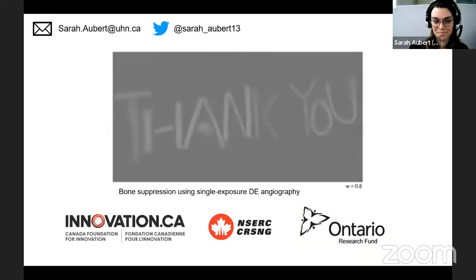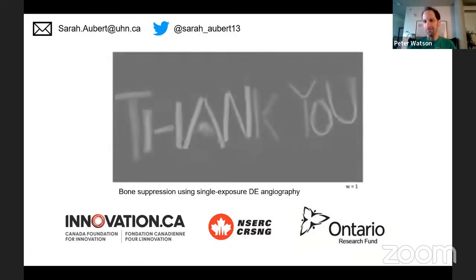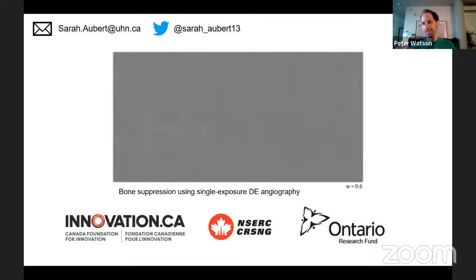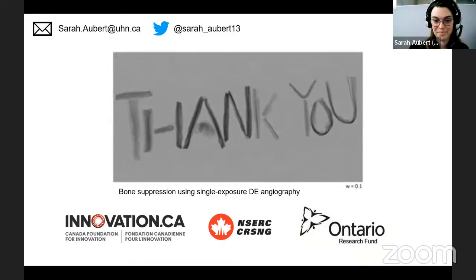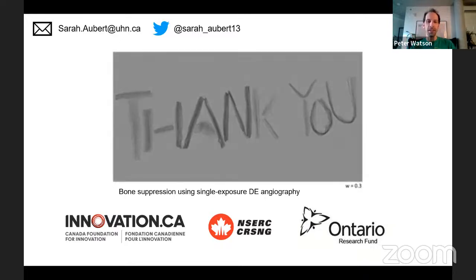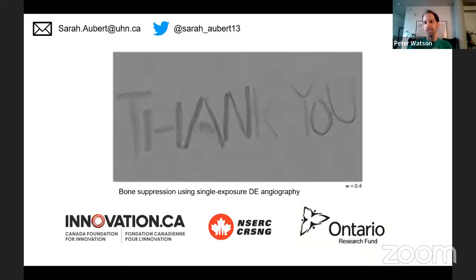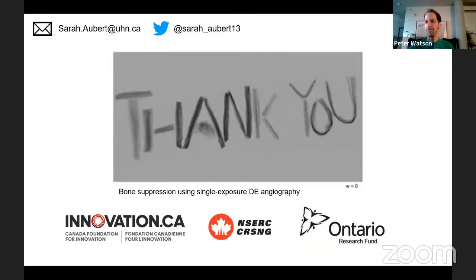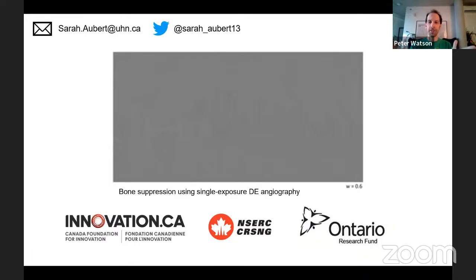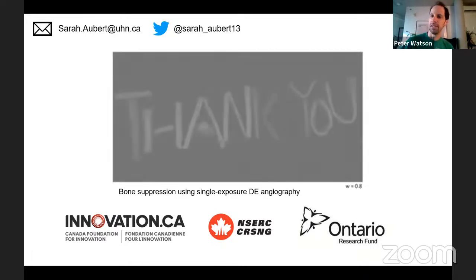And from the images you showed, it looks like it really does enhance the SDNR because essentially you're removing noise. Exactly, yeah. Signal stays the same, noise decreases, SDNR goes up. I'm curious though, does that affect your detectability of edges and small features? Because you're essentially removing that content. From the images you showed, it's very obvious what is a vessel and what isn't. But what if you had something that was more detailed?